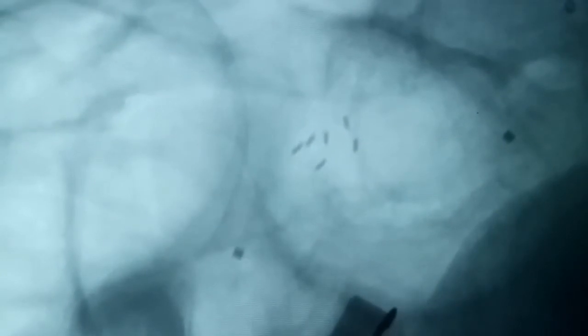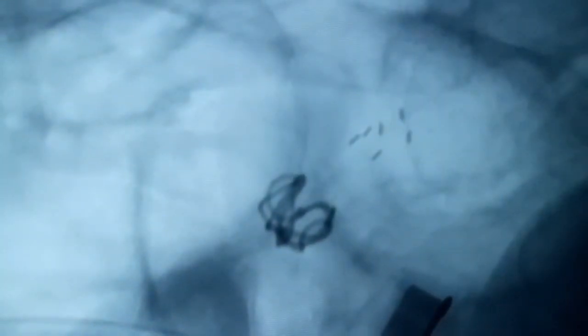We have taken a Neuro Atlas stent and deployed it from the M2 across the aneurysm and into the M1, nicely covering the M1 and the inferior branch of M2 with the aneurysm. We then start putting coils into the aneurysm.